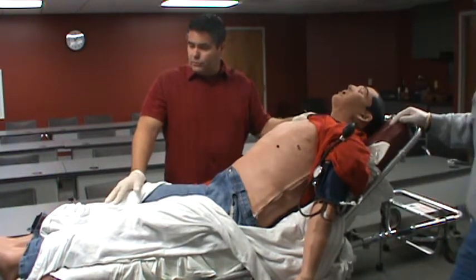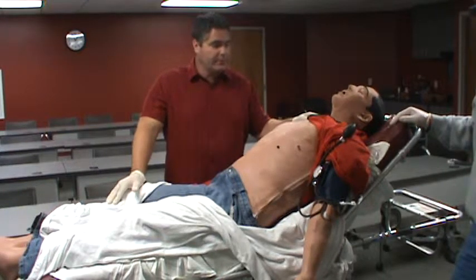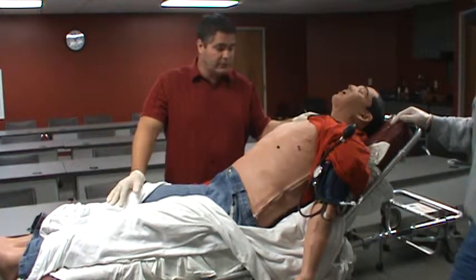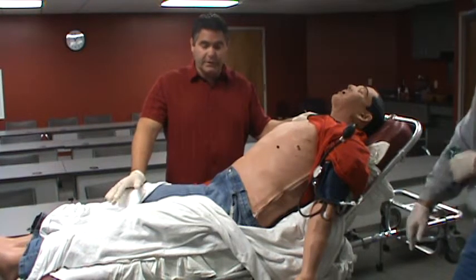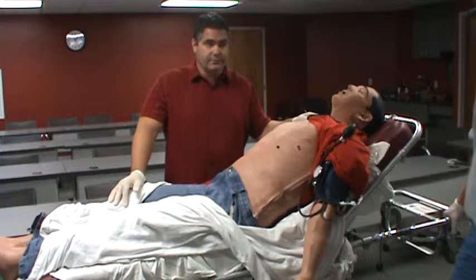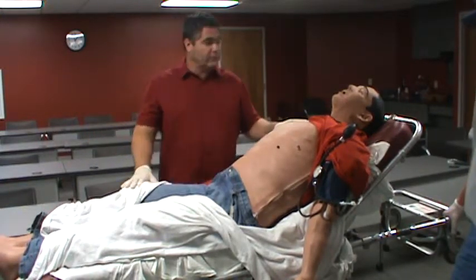This simulator can also show convulsions. They're pretty subtle, but if you look you'll be able to see them if you're not touching the simulator. He can also be programmed to bleed from some moulage points that we have purchased. So depending on what your simulation is, you may find some open wounds that are bleeding as well, both venous and arterial.